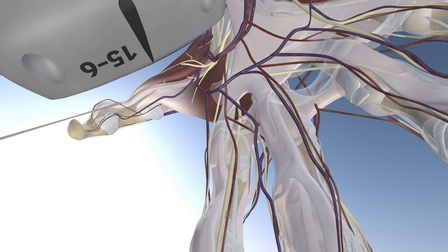Here is our probe with our needle. We're going from distal to proximal, and essentially advancing our needle into and around the tendon sheath of the flexor pollicis longus tendon, and injecting our mixture of saline with cortisone in this particular case.